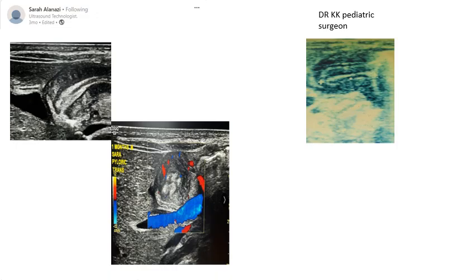So this is from Sarah. She's from Saudi Arabia. She had sent me these pictures on LinkedIn. How exactly would you find out that this is a pyloric stenosis? Let's have a look. This is a longitudinal view. And this is the lumen, which is terribly compromised. See, small lumen. Not only that, the muscle is all nicely hypertrophied, about 4 millimeters in size on the ultrasound.